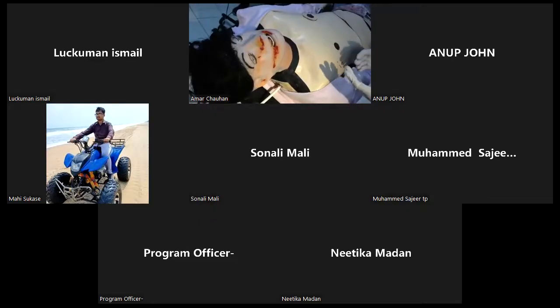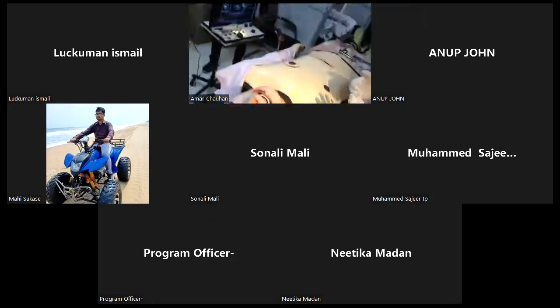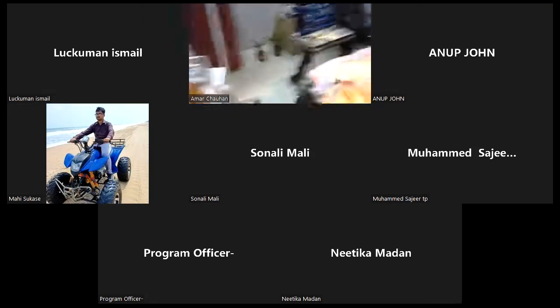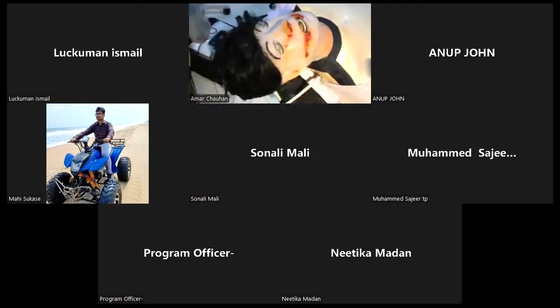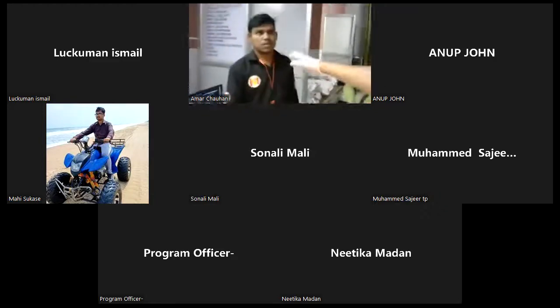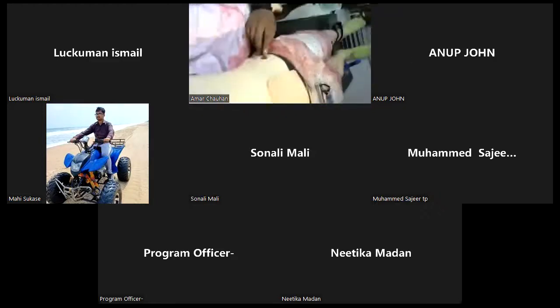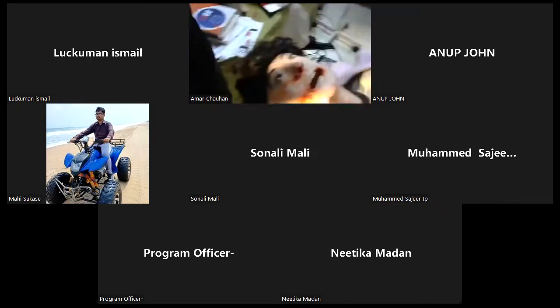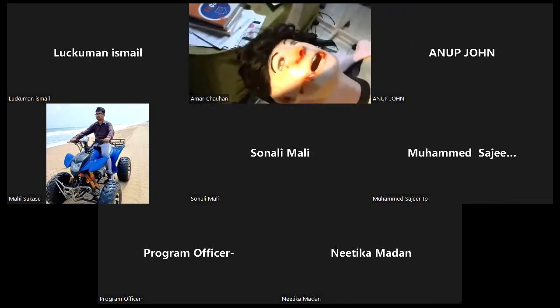Unstable vitals. So first thing is that if you press that button, this is our mannequin operator. Show him to press the button, and then it will have some sound. So it has audio cues.